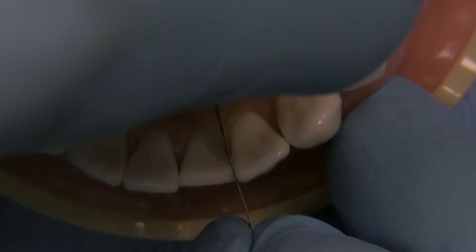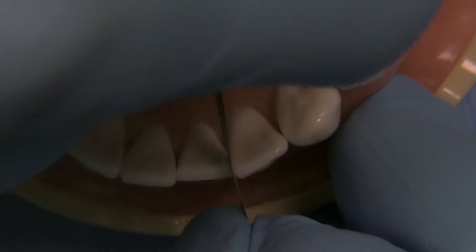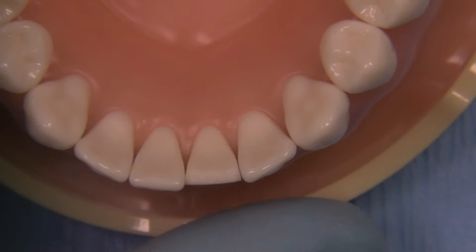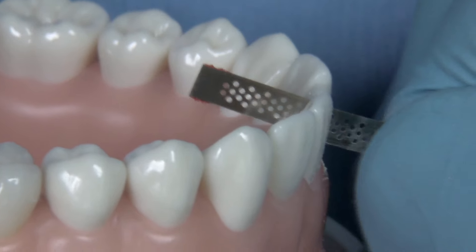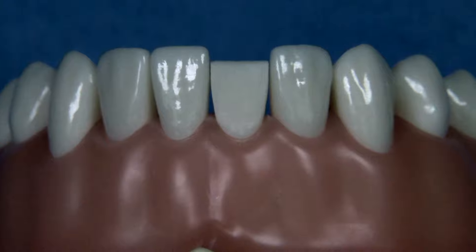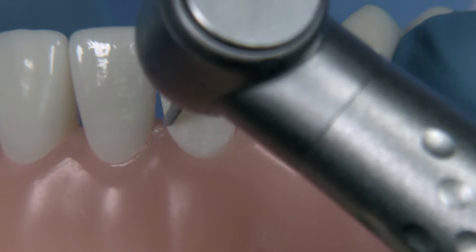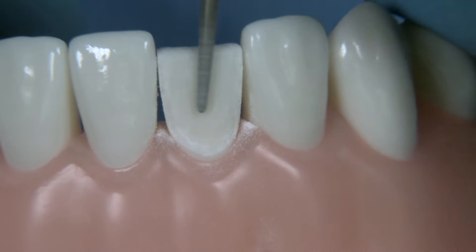Just use a little bit of this strip to create some IPR, which the laboratory will then be able to use to separate the dies without damaging the finish line in the die material. This was taught to me by Dr. Ed McLaren about 20 years ago and I've found this to be essential for veneer preparations. There's no need to wrap interproximally to break contact. In our technique for cementation of veneers, I can mitigate staining of the margins by etching around the margins. We're creating just a little removal of the adjacent tooth — a sliver of space — that will be closed with the final veneer. I also find it helpful to use the bur in a horizontal manner, just using the tip of the bur to create a little bit of bulk at the finish line, which can help the technician greatly to avoid thin areas of ceramic.